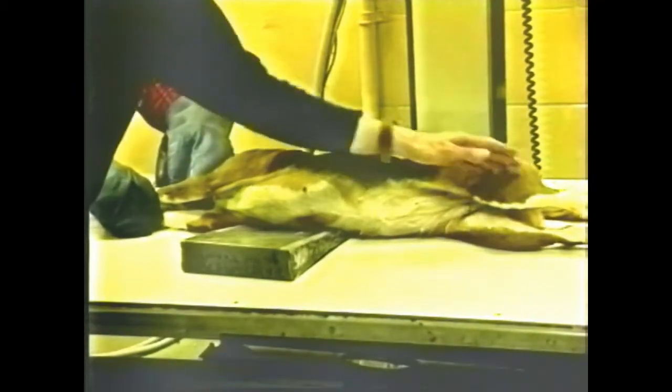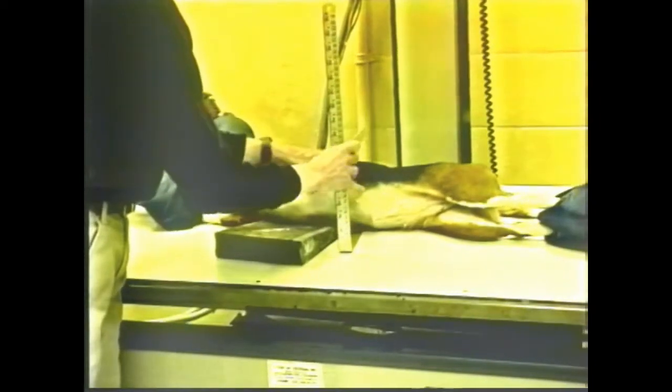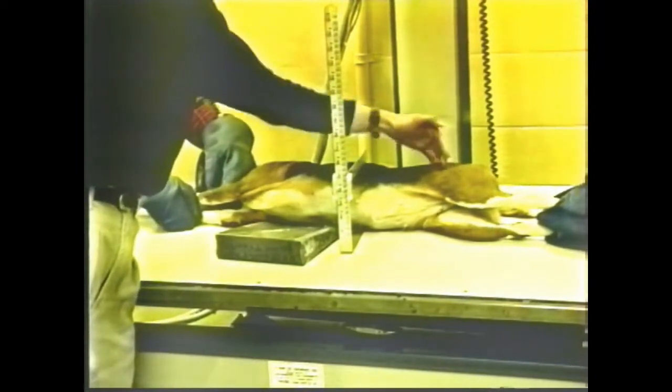The animal is placed in lateral recumbency. Care must be taken that the sternum is at the same distance from the table as the spine. The animal must be measured at the greatest bow of the ribs, which is the thickest part of the abdomen.